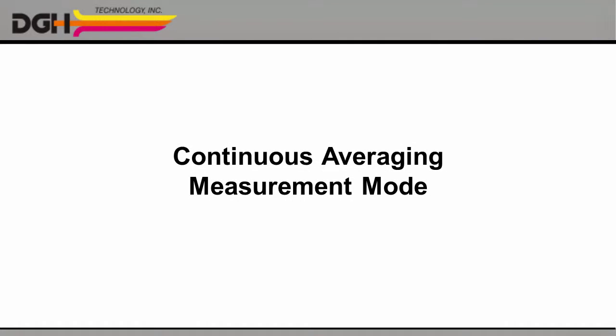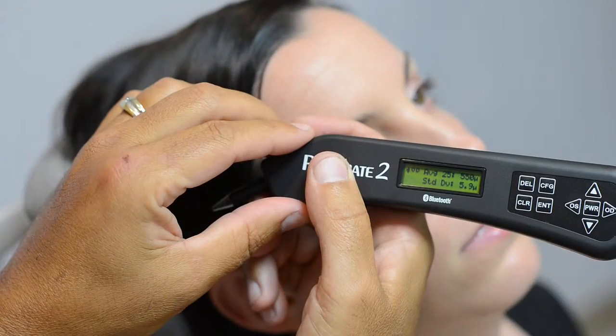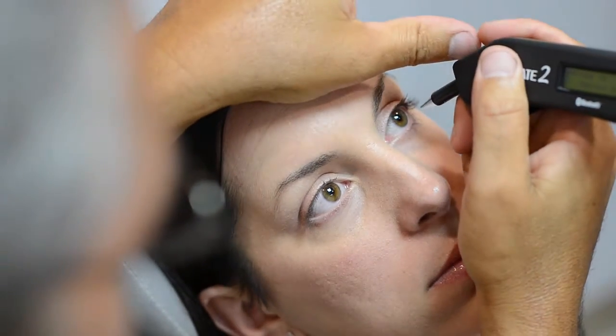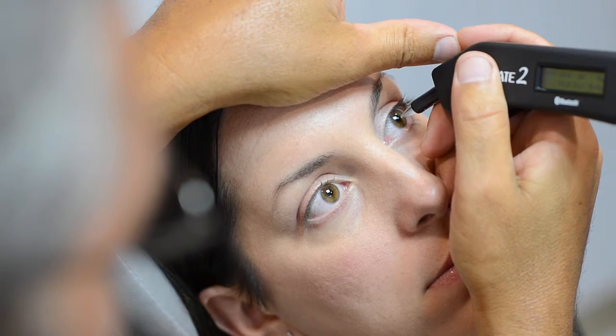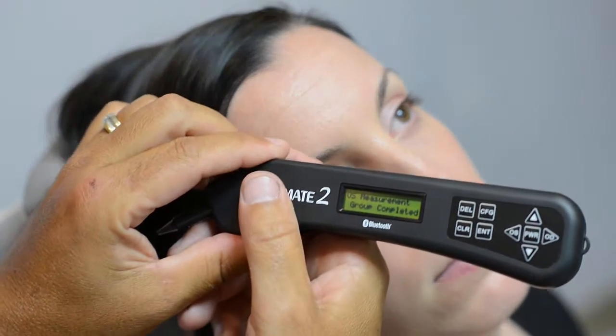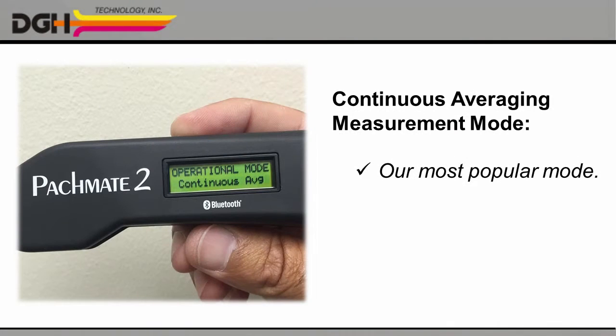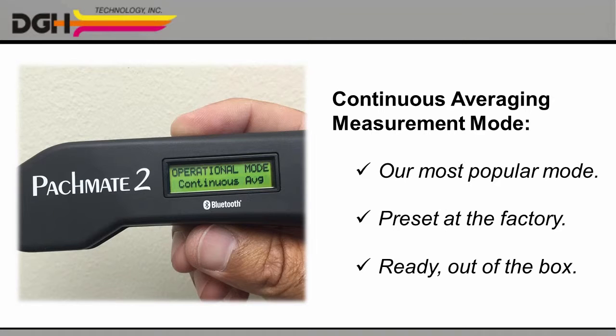The continuous averaging measurement mode is used primarily for glaucoma and LASIK screening. In this mode, you only need to measure the patient's cornea in one location. In a little more than a second, the PacMate II will take 25 separate measurements. The unit then automatically displays the average of all the measurements, as well as the standard deviation. This is how most technicians use our Pacimeter, and it's also how we ship the unit from the factory. So if continuous averaging is what you need, you'll be ready to start right out of the box.